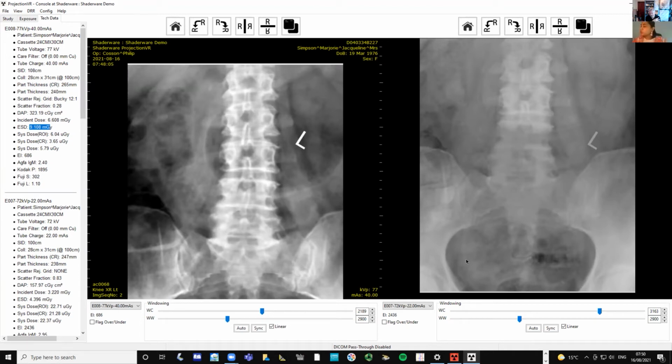I actually have lots of questions, but my number one question is: what is the accessibility of the software? Is it mobile based? Is it computer based? Or if it's a computer, will there be specific specifications for the computers?